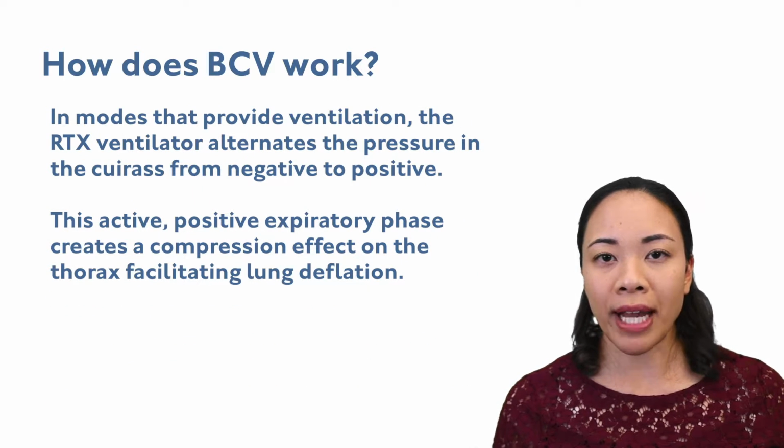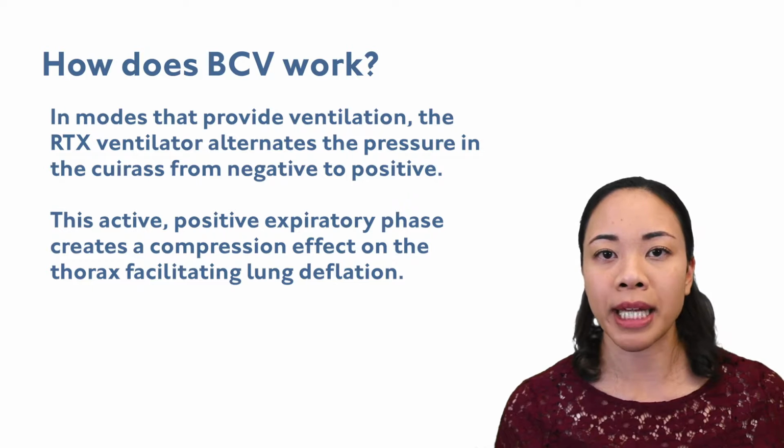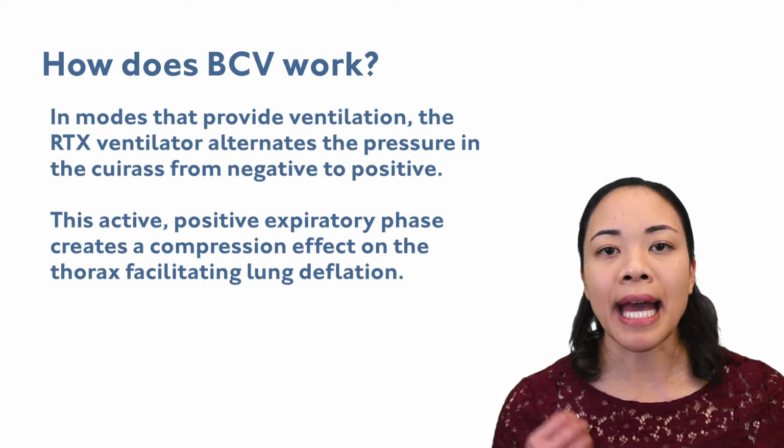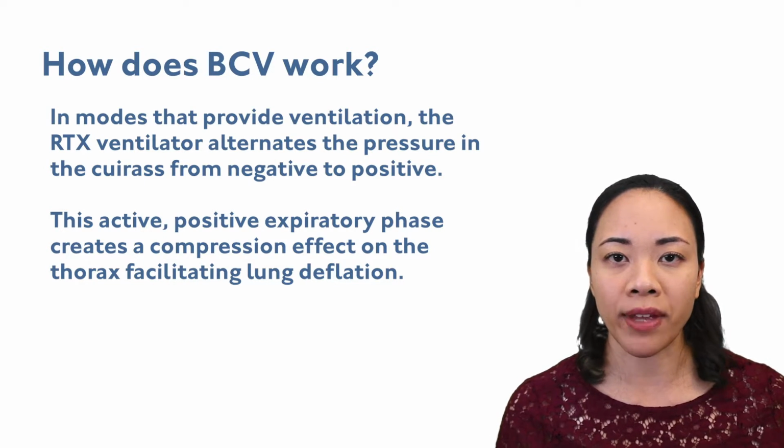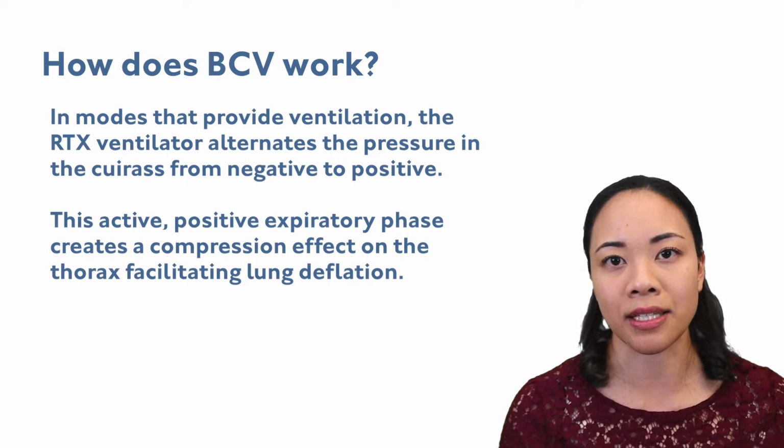In modes that provide ventilation, the RTX ventilator alternates the Cuirass pressure from negative to positive. This active positive expiratory phase creates a compression effect on the thorax, facilitating lung deflation.